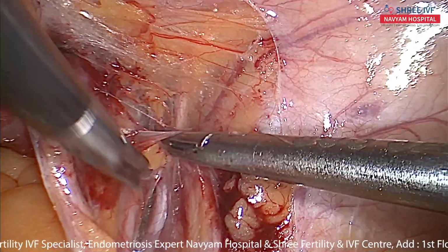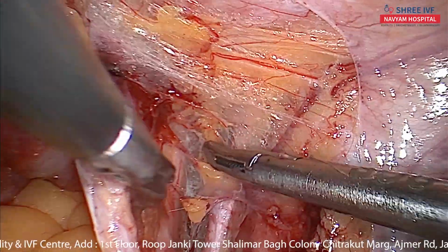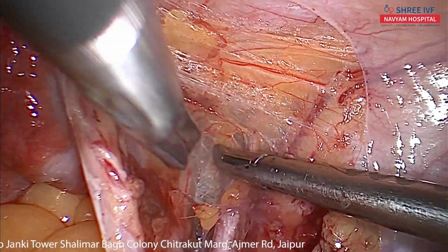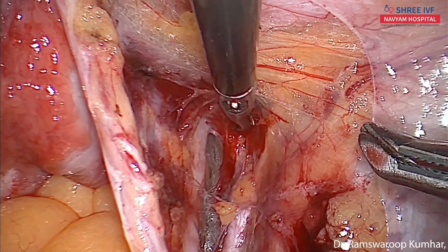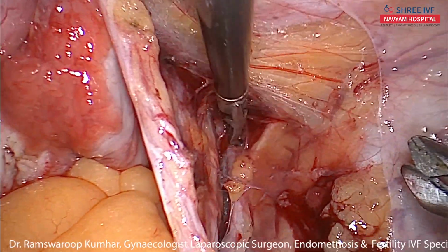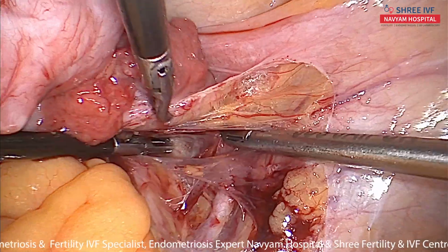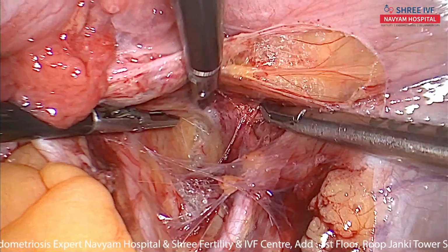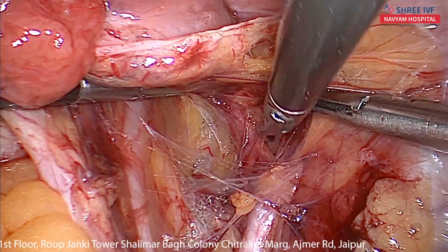Little oozing, we should tackle it immediately, otherwise it will spoil our field. We have entered, the blunt traction is good. This is slight oozing, we have to tackle it. So gentle dissection is the need, and I will hold the ureter below my instrument and then dissect the uterine artery further.